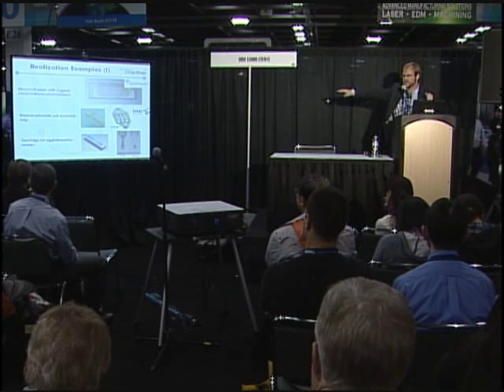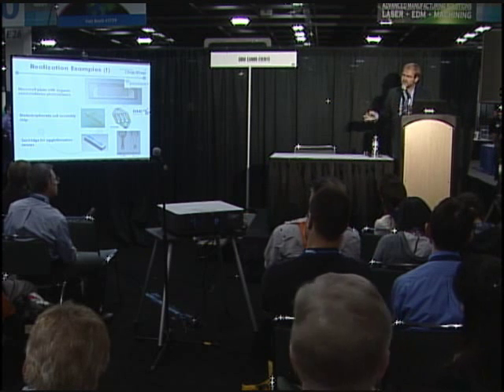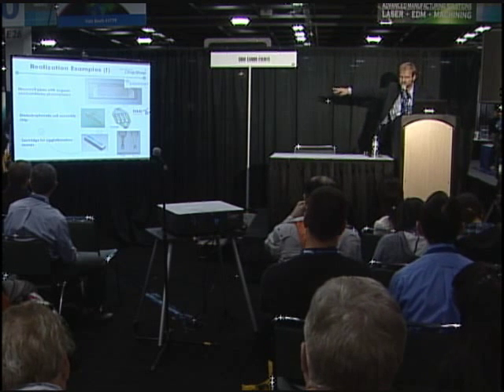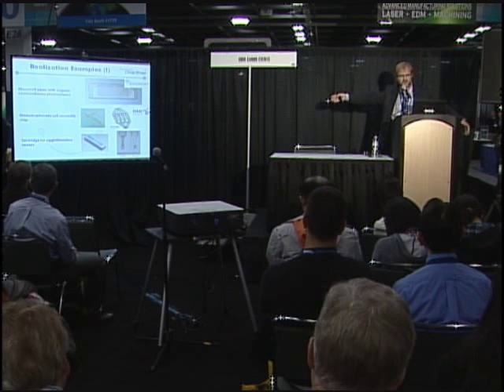In this case, this part has a multiply bifurcating network of microchannels, again, antibody coated. And if you have a positive reaction, which is an antigen reaction, agglutination, a blood clot forms, and it just blocks the microchannel. And it comes for free because it falls out of the injection molding machine like that.